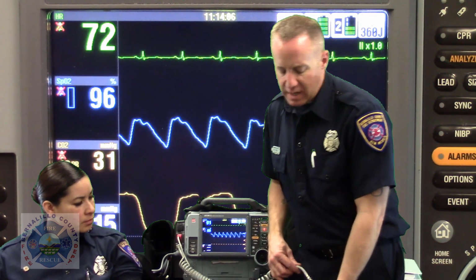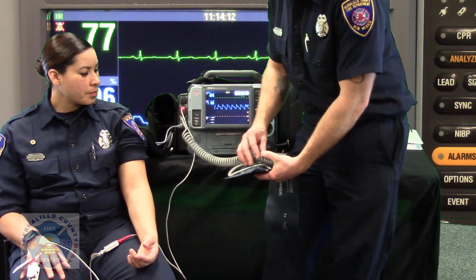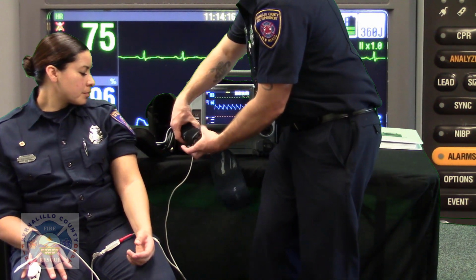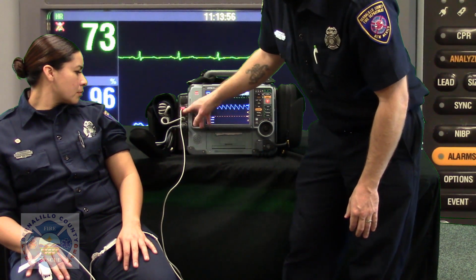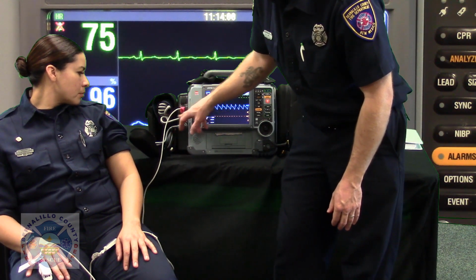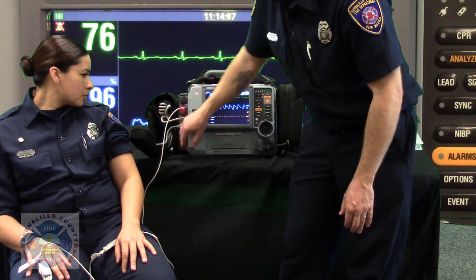So one technique you might appreciate is I always like to just roll the air tubing without letting it kink, and I'm just going to roll it back on itself and protect it with the cuff and into the top pouch. You'll appreciate that the location of the pouches corresponds with the cable you're trying to store. So if the BP cuff is stored in the upper, that leaves the lower for the 3-lead ECG cable.